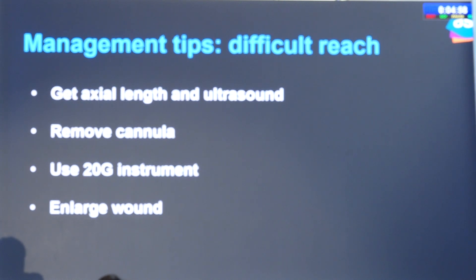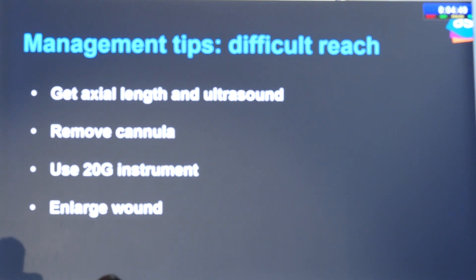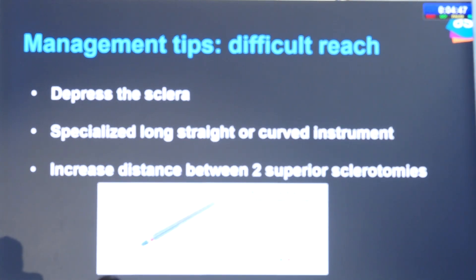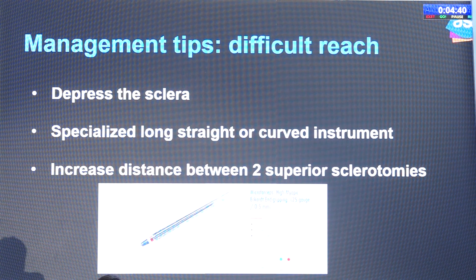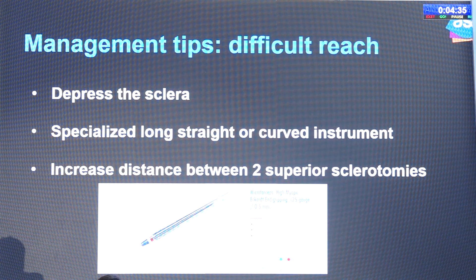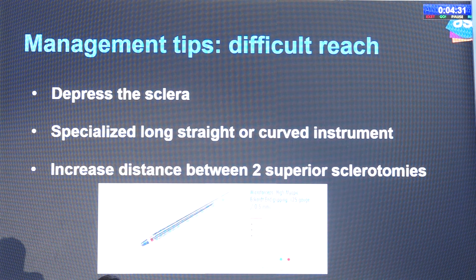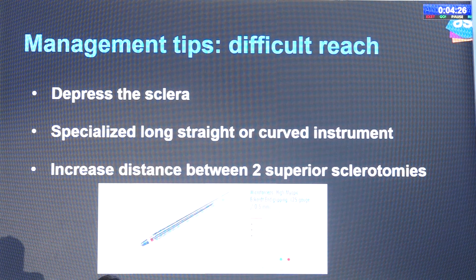When I cannot reach the posterior pole, I usually remove the trocar and cannula and enlarge the wound, then go through with the same small gauge instruments. You can also use 20 gauge instruments. Sometimes you can depress the sclera at your working end to try to reach the area, but that can distort the cornea and limit the view. Specialized long straight or curved instruments are available. The distance angle between the superior two sclerotomies can be increased to help in maneuvering.